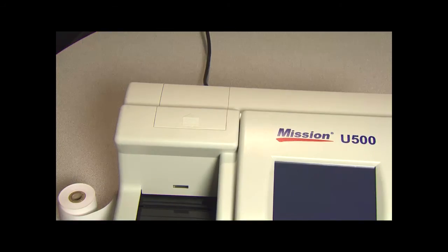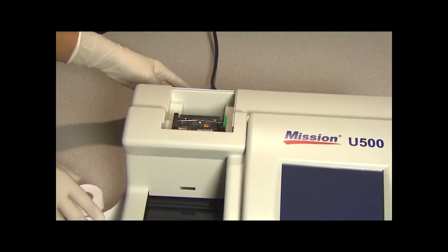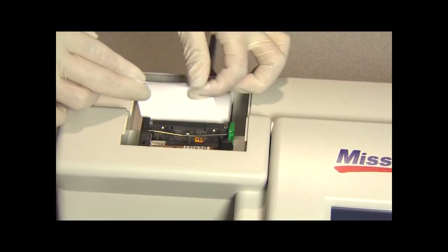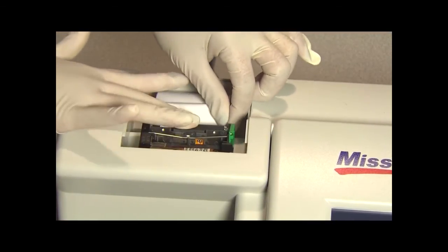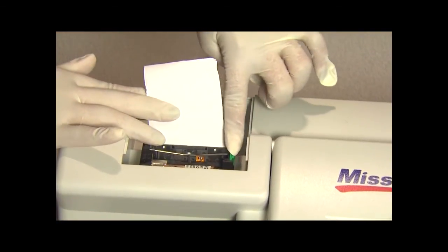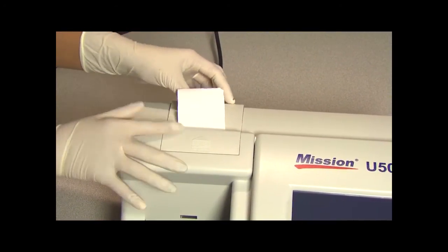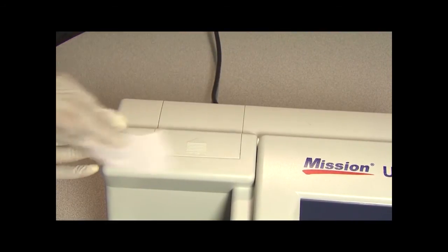To load the printer paper into the internal printer, first pull up on the finger pull area to open the printer cover. Then place the paper roll in the printer box and feed the paper under the printer feed roller until the paper sensor threads the paper through the printer. Then return the printer cover to the closed insert position.